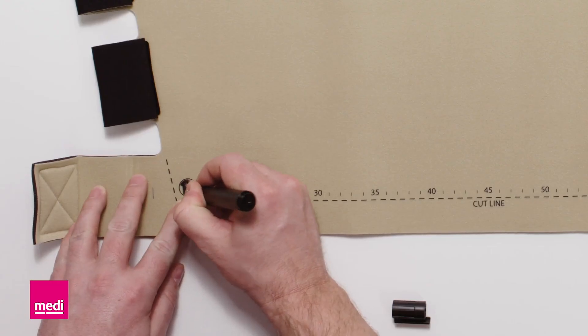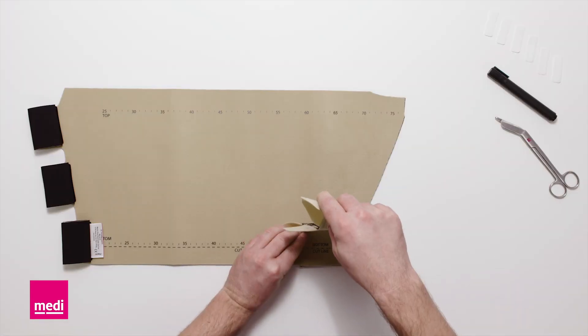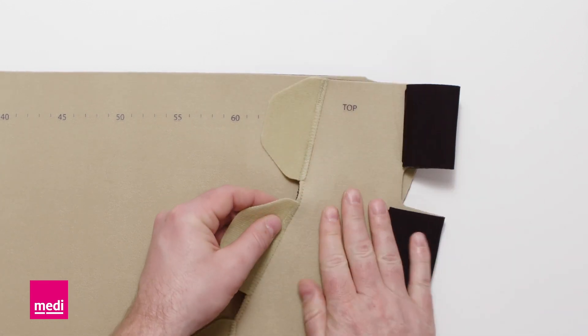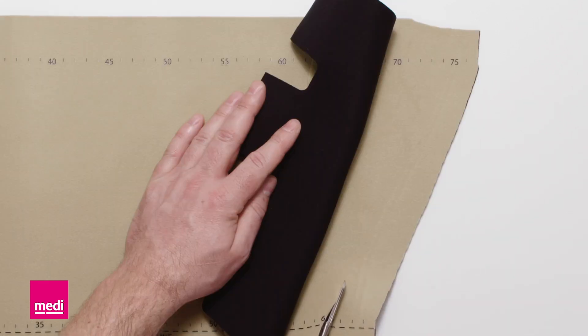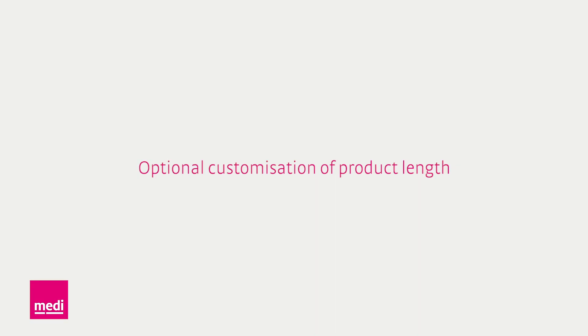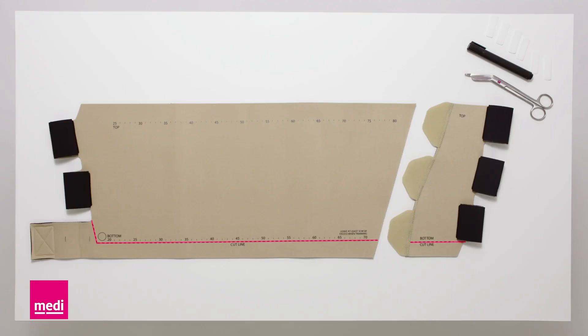Label the garment for the right or left leg accordingly. As soon as the leg has decreased significantly in circumference, trim the garment to the new measurements and remove the excess material. For an optimum fit, the product length can be trimmed by 3 cm.